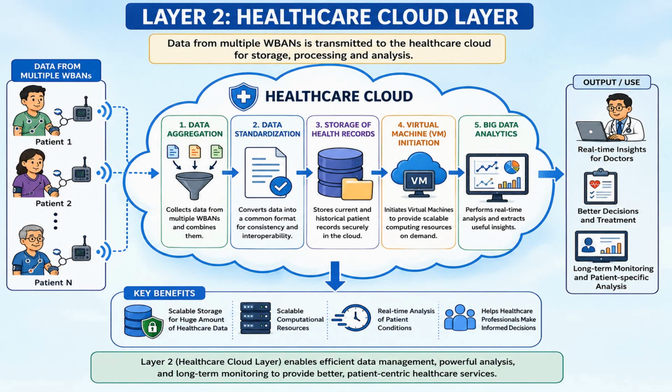So here you can say that the healthcare cloud layer acts as an intelligence center of the AmbuSens system by providing scalable storage, powerful computation, secure data management, and real-time analytics. And this layer helps the healthcare professionals make informed decisions while ensuring efficient and continuous patient monitoring.